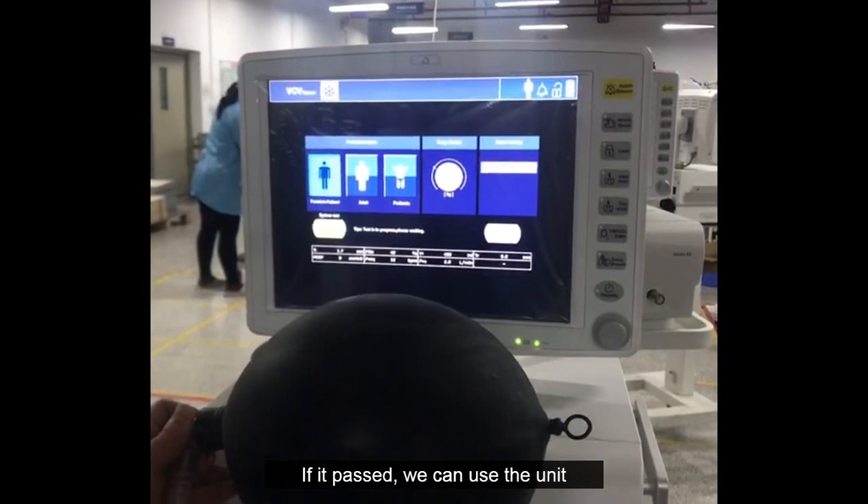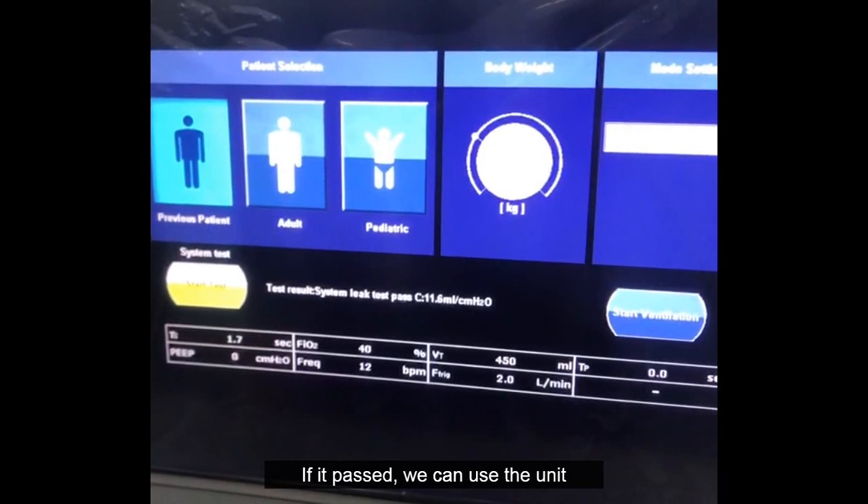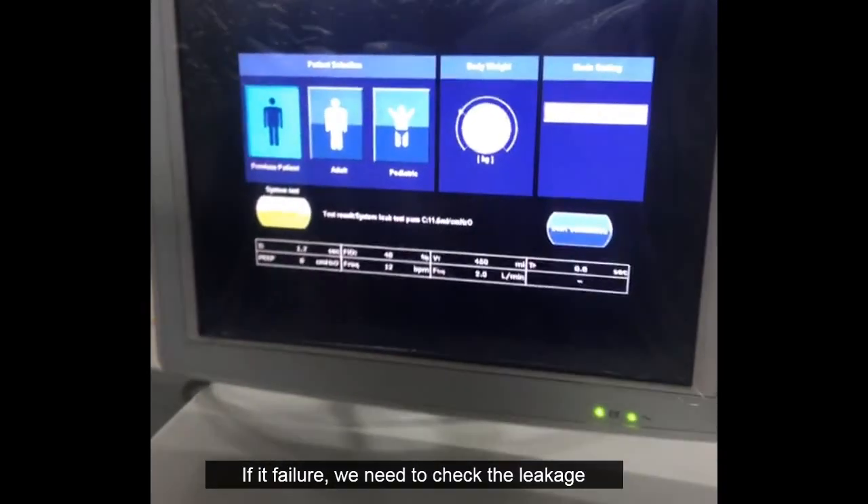If the system test passes, we can use the unit. If it fails, we need to check for leakage.